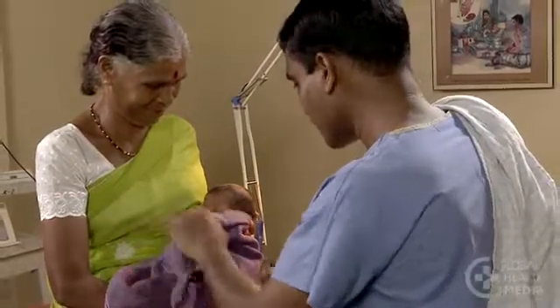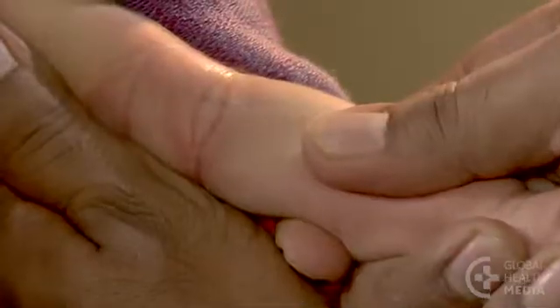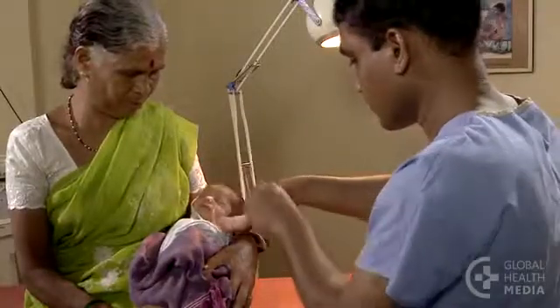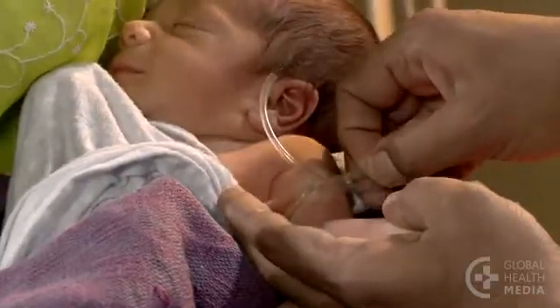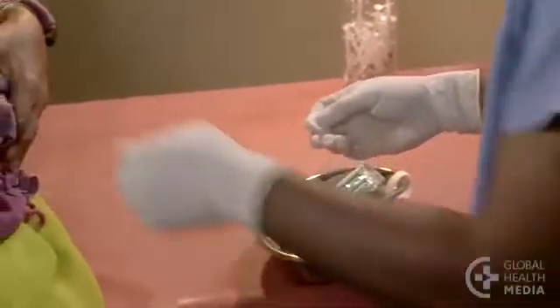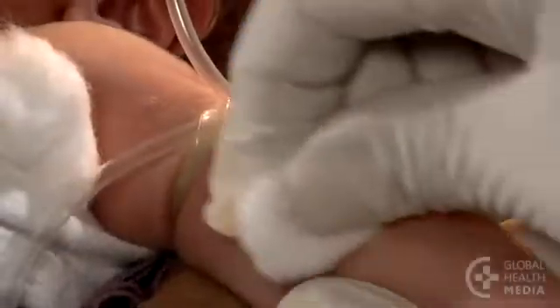Here, we draw blood using a sterile needle and syringe. Find a good vein. Then tie the tourniquet so you can easily release it. Put on your gloves. Then clean the skin well 3 times and let it dry.